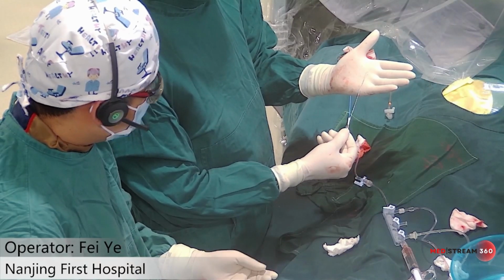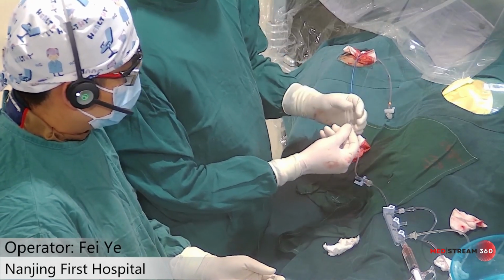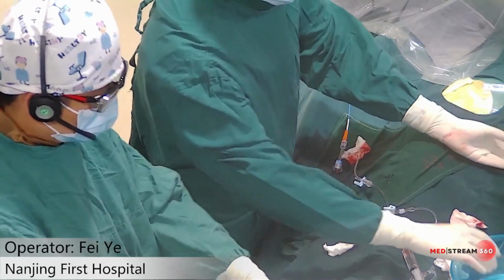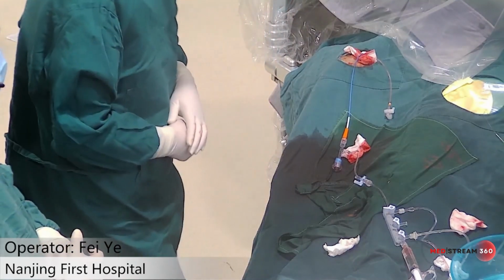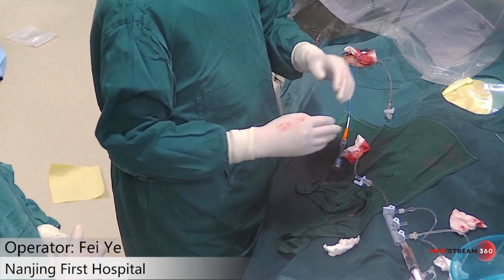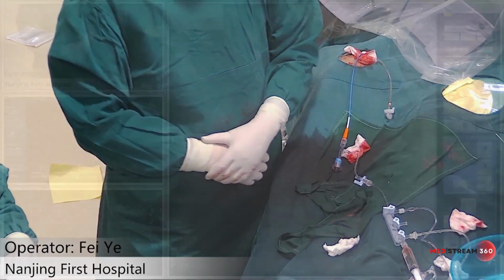So, with a double curve on the workhorse wire and a very short length. Okay. After that, we should use a double lumen catheter or microcatheter to negotiate the ostium. First, we use a microcatheter just because the microcatheter was on the table before we treated the distal CTO lesion.